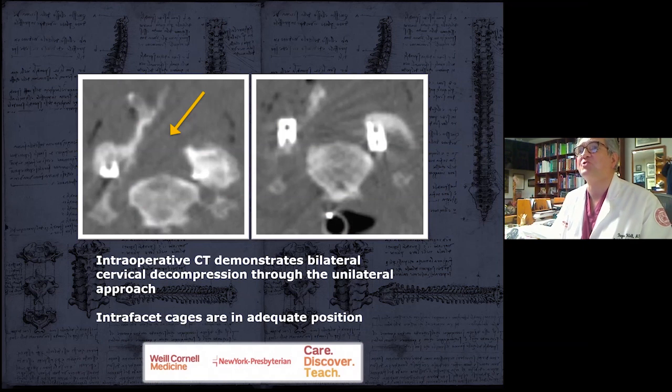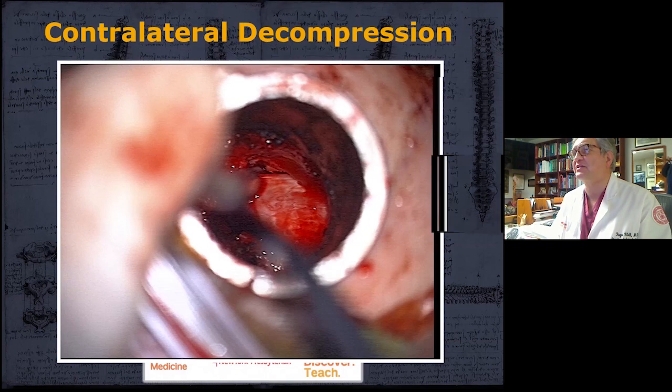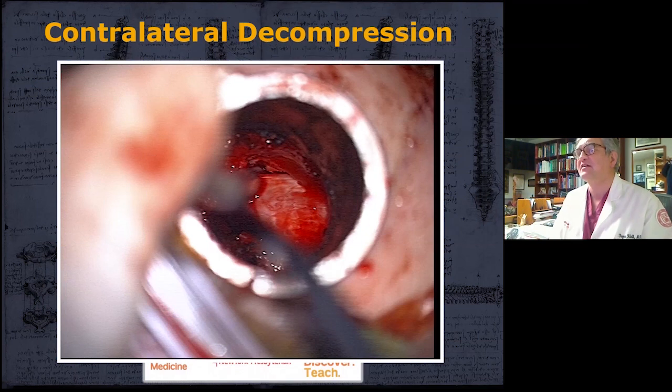And that's the intraoperative CT scan that we got just to confirm that we've got a nice bilateral decompression. Also put little facet wedges in at the same time to stabilize that level.